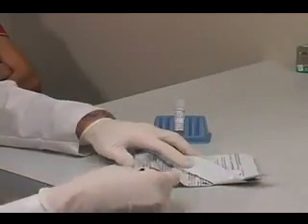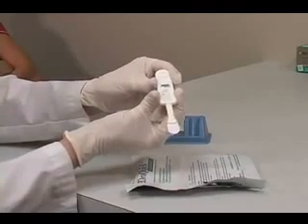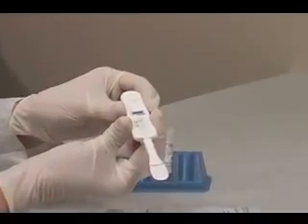Remove the device from its pouch. Do not touch the flat pad. Check to make sure an absorbent packet is included with the device. If no absorbent packet is present, discard the device and obtain a new pouch for testing.